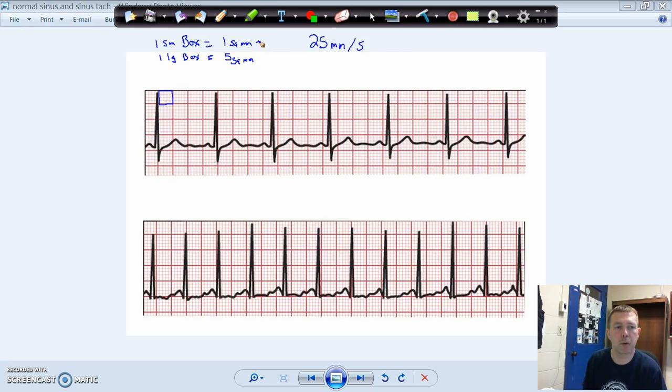One small box or one square millimeter equals 0.04 seconds. So that makes the five square millimeter box 0.2 seconds. So 0.04 seconds in time is one square millimeter. Each five square millimeter box equals 0.2 seconds in time.